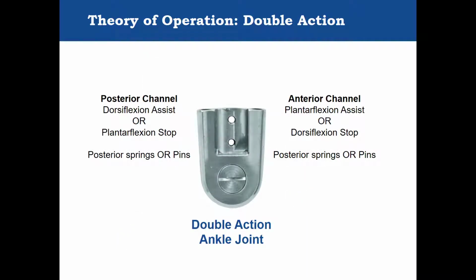The double action is a versatile orthotic component that can be used to assist or block ankle motion depending on whether springs or pins are installed in its anterior and posterior channels. Double-action springs provide moderate resistance to ankle motion, making them best suited to the management of mild swing phase gait deficits. These springs permit a high range of active motion, and so are best suited for patients with low activity levels.